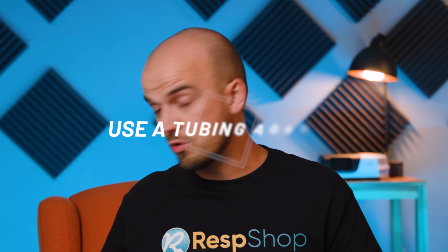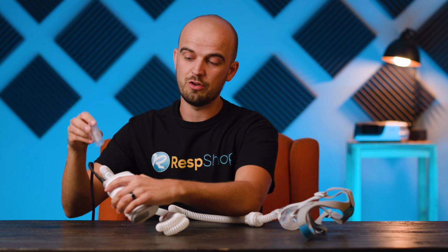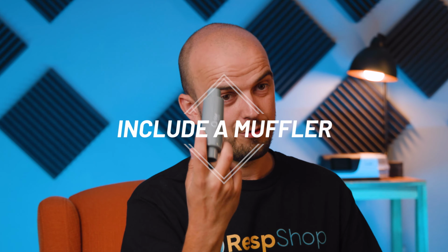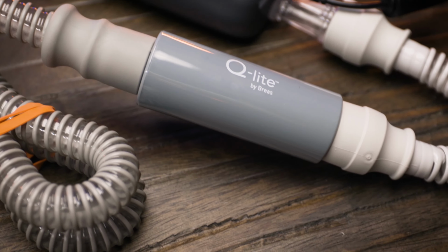Number 1, you can use a tubing adapter. Instead of this ResMed one here, you can use this, and that will allow you to use a standard tube, bypass the HumidX filter altogether, go straight into the unit. All right, and if that doesn't help all by itself, then we have a muffler. Using the Q-Lite muffler here, we just dampen the sound overall.